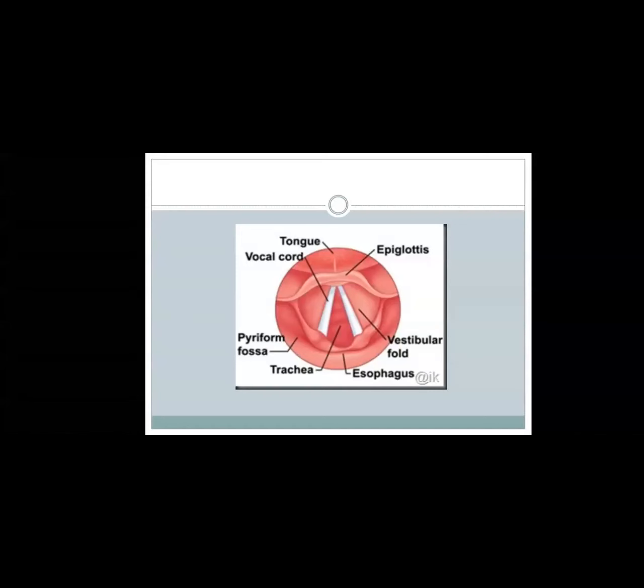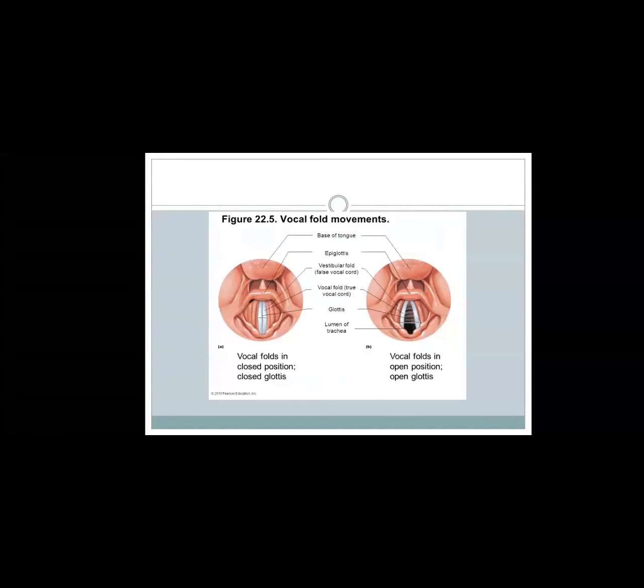When you ask the patient to produce a sound from the larynx, you can see the vocal cord movement.